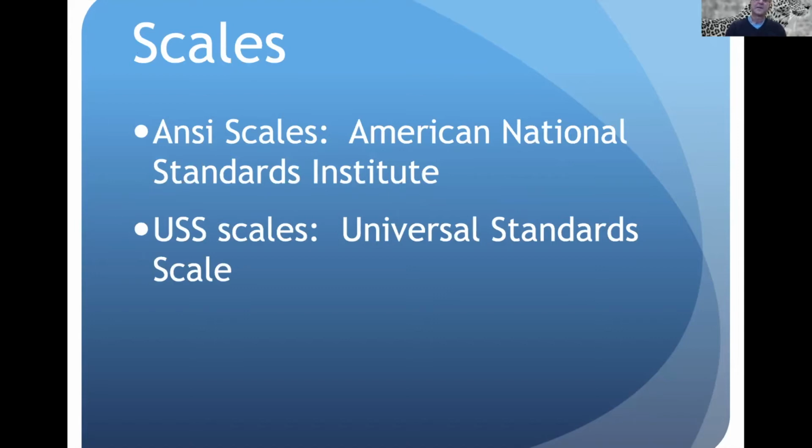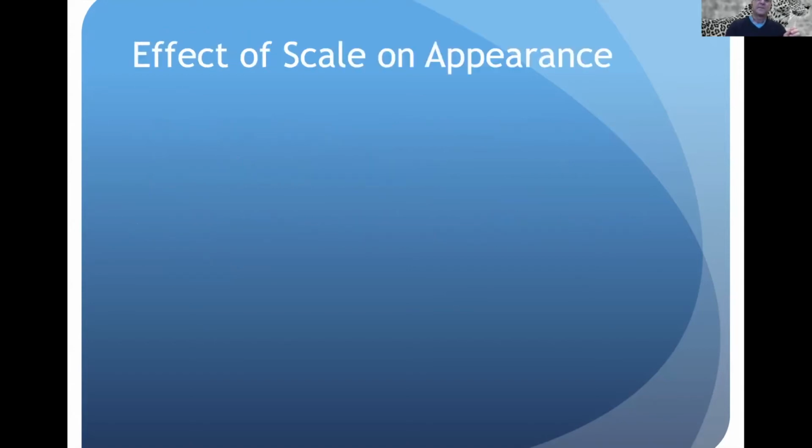There are 2 other scales which I just mention here as an aside. I don't think I've ever used them, but having been humbled by my association with a giant like Steve Kleiss, I rely on whatever he says.